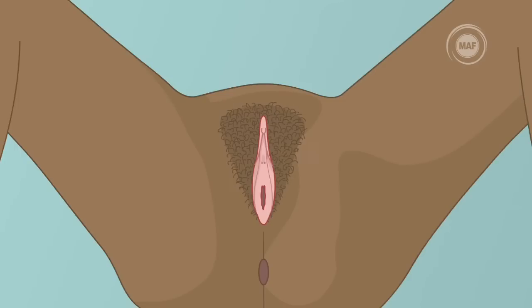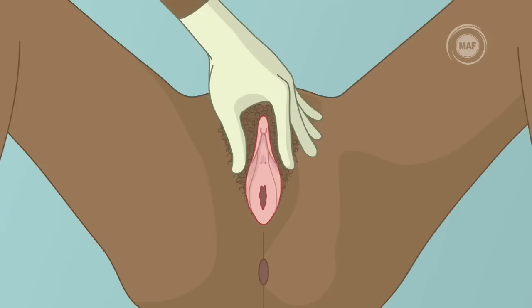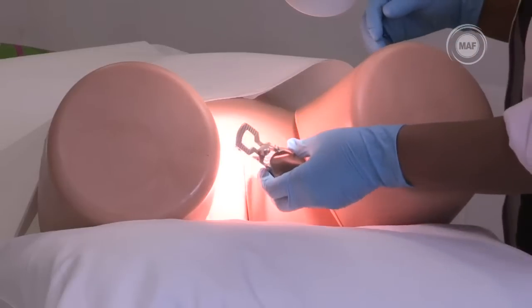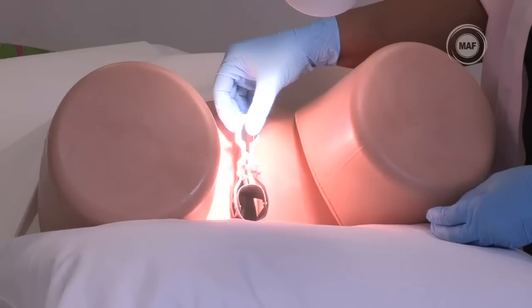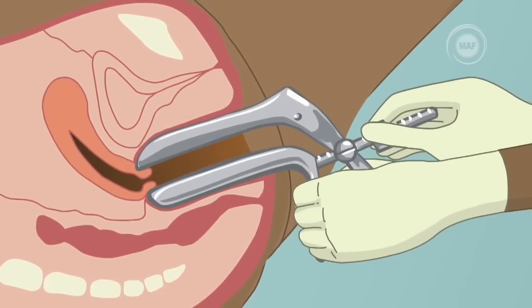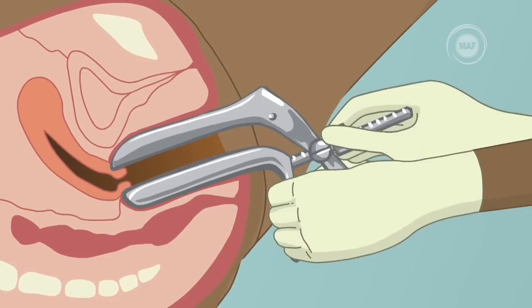Before you insert the speculum, you should first examine the external genitalia and perineal region for any signs of sexually transmitted diseases or abrasions. Then insert the speculum gently into the vagina by holding the speculum blades together and slipping them in. Be careful not to press on the urethra or clitoris. Gently open the blades and move the speculum slowly until you can see the entire cervix, then lock it in the open position.